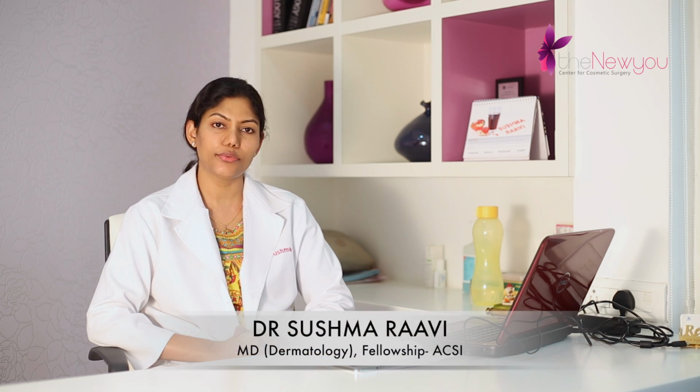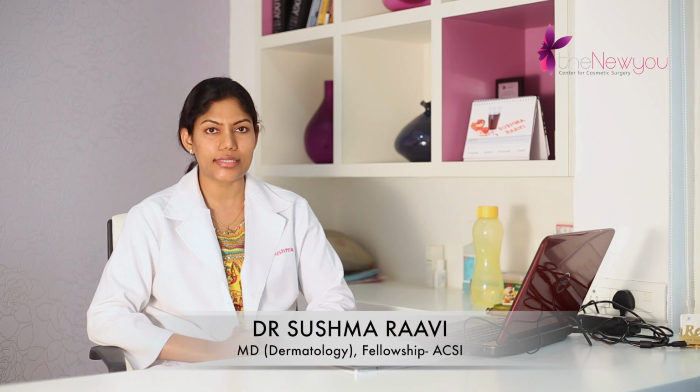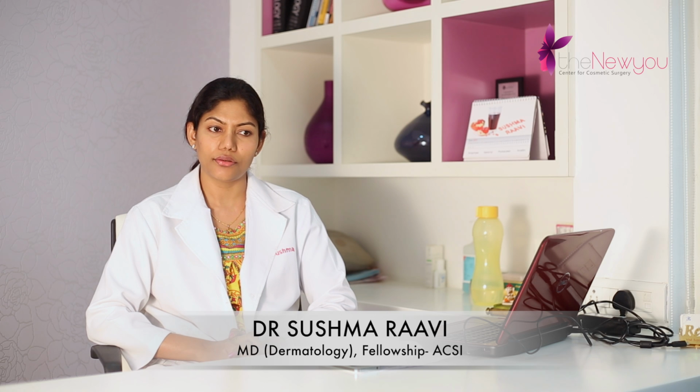I am Dr. Sushma. Today I am going to talk about fractional CO2 laser. Fractional CO2 laser can be done in conditions like aging of the skin. It helps acne scars, it helps stretch marks, and also it can be done in case of pigmentation spots on the skin. So first, coming to aging.